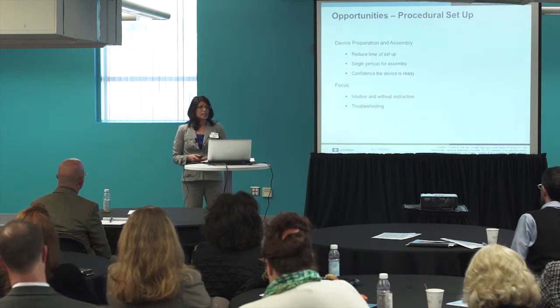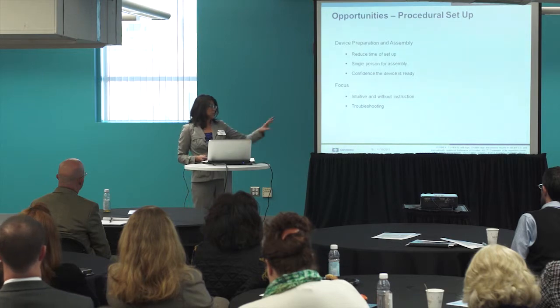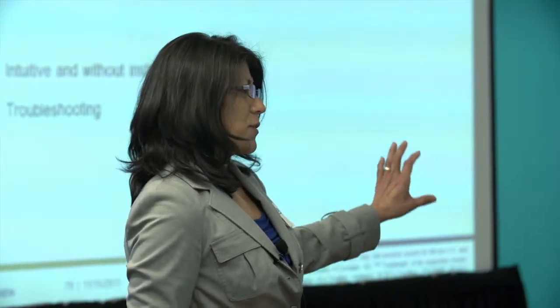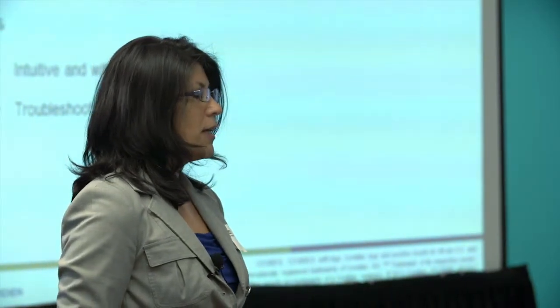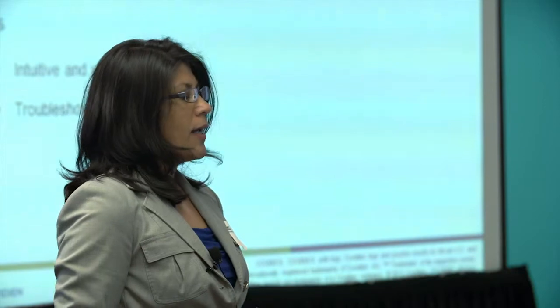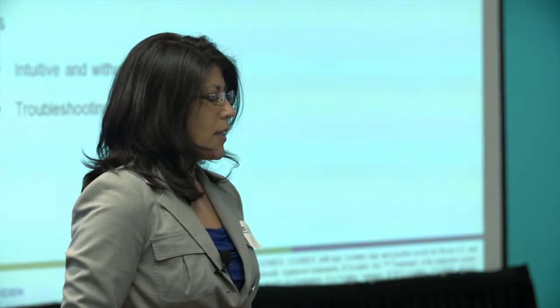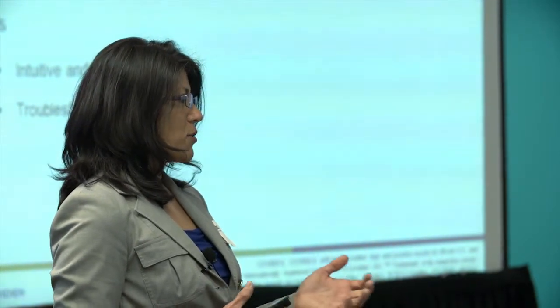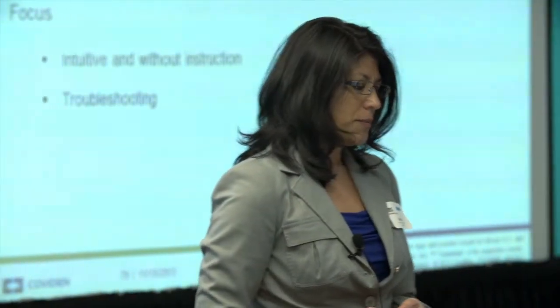So specific design considerations that we made. First and foremost, the device connections, which were transitioning from the non-sterile environment into the sterile environment. Secondly, the number of components that we had, how we would separate the parts, and the form factor of those parts. And then how to maintain the sterility of those parts if we were deciding to use reusable components. So with that, there were decisions on the technology, the materials that we were going to use.